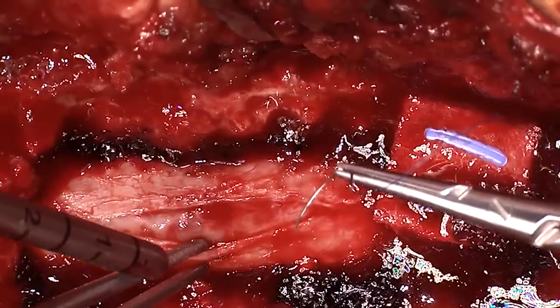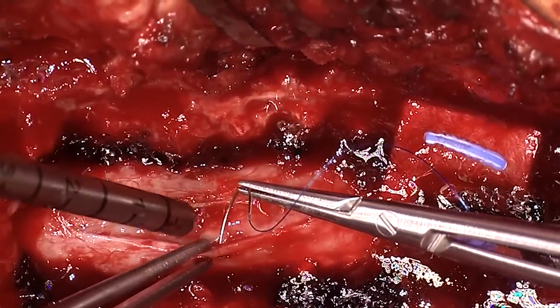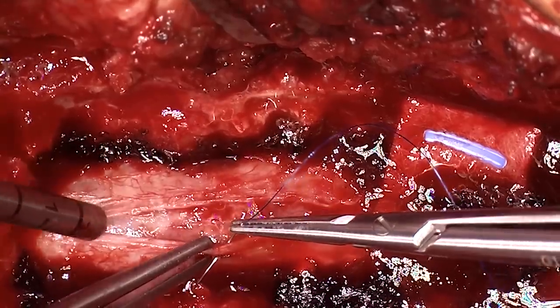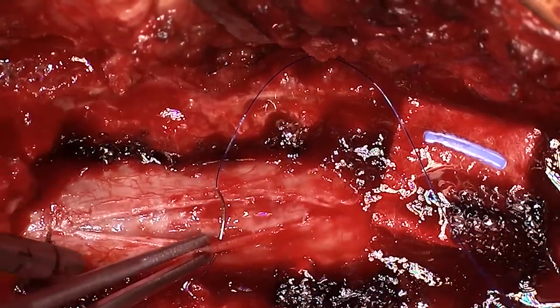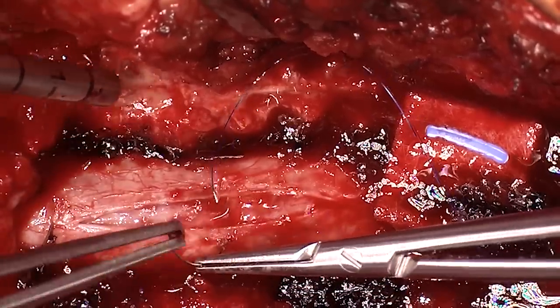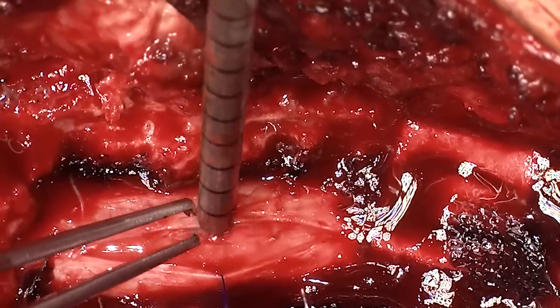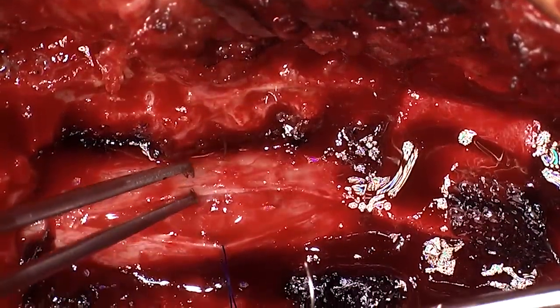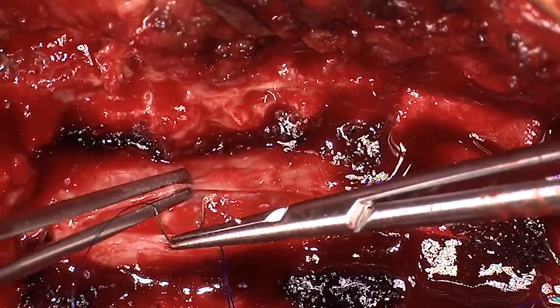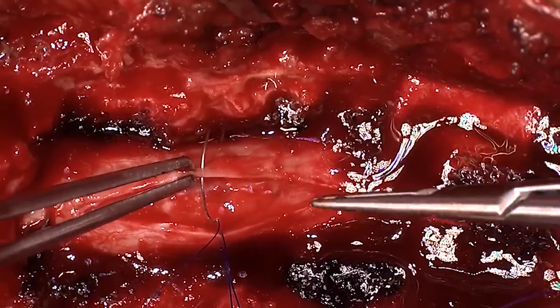A bit of bleeding is to be expected and that will come from the dural edges. So because these edges are in the way we take these tiny little stitches - and remember we're doing this under a microscope so these are very very small stitches indeed - and we'll use these to hitch the dura away from the spinal cord and anchor it away. This is a slightly finicky process and can take a little bit of time especially tying off these stitches with instruments.